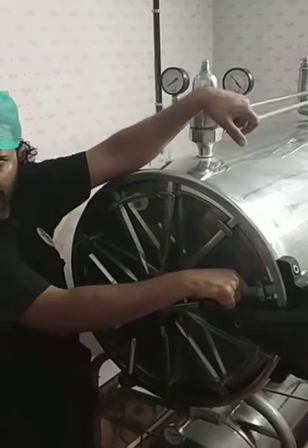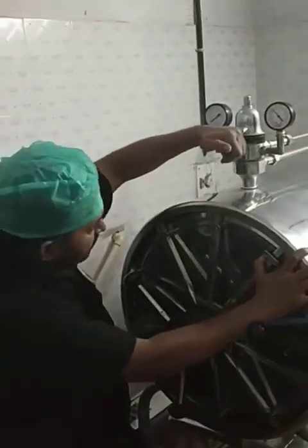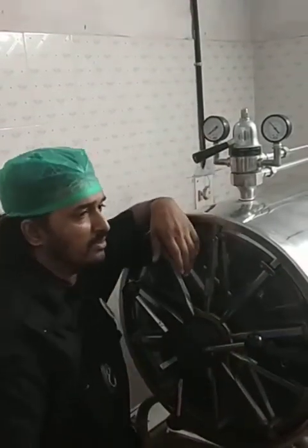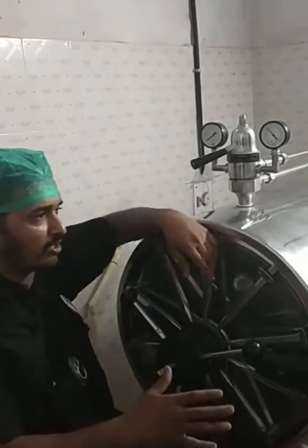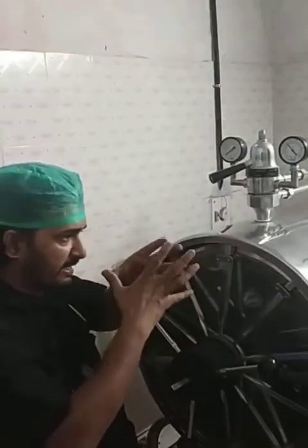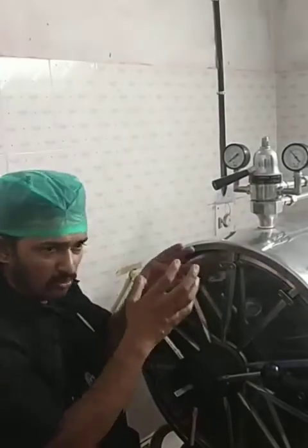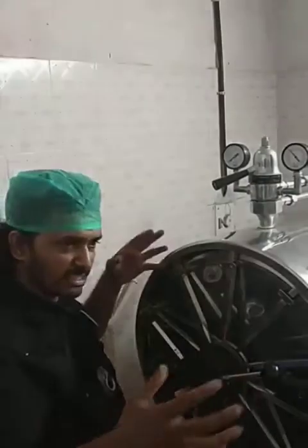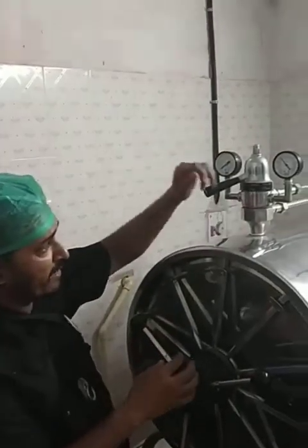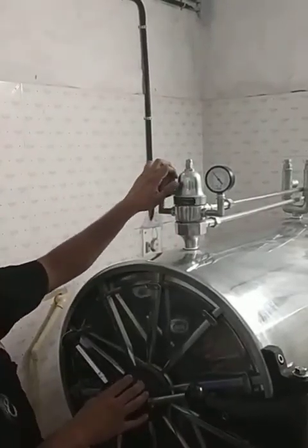We wait for 5 minutes in this particular equipment. Then we go for a vacuum step. Vacuum is the key drying step in the autoclave — once all the steam is out, a vacuum is created inside. That vacuum pulls all the moisture and drops towards the side of the autoclave so the sets get dry. After around 5 to 10 minutes of vacuum, we go for the close option.